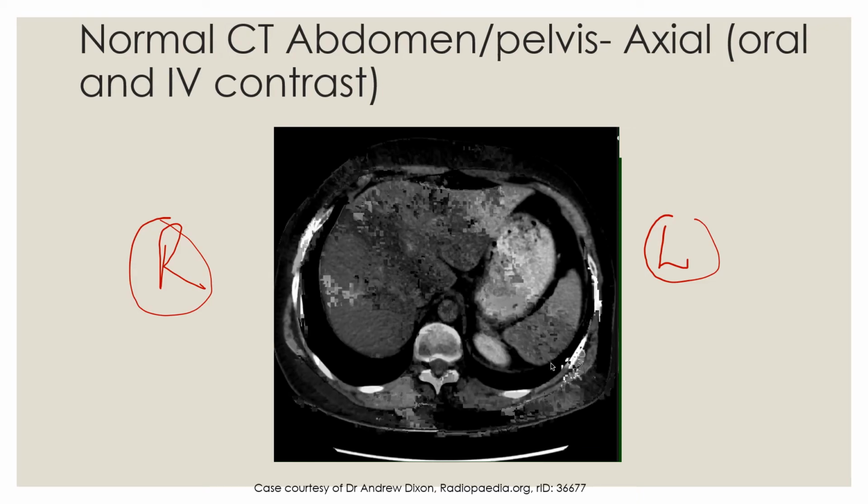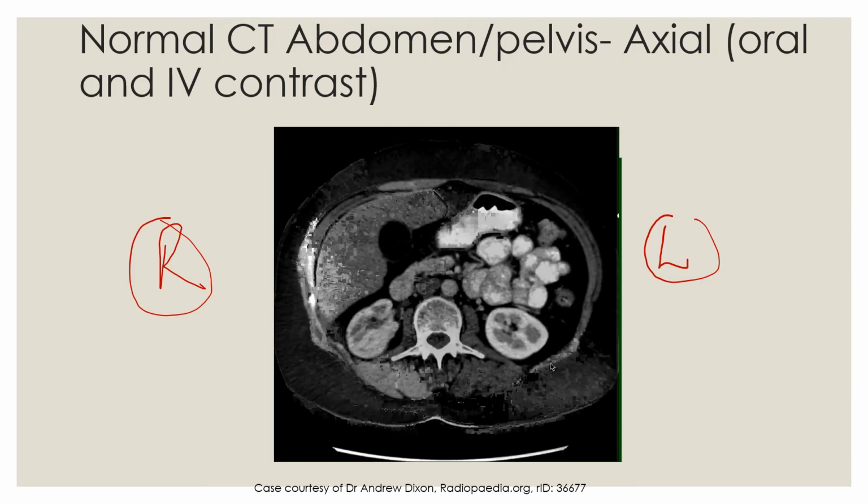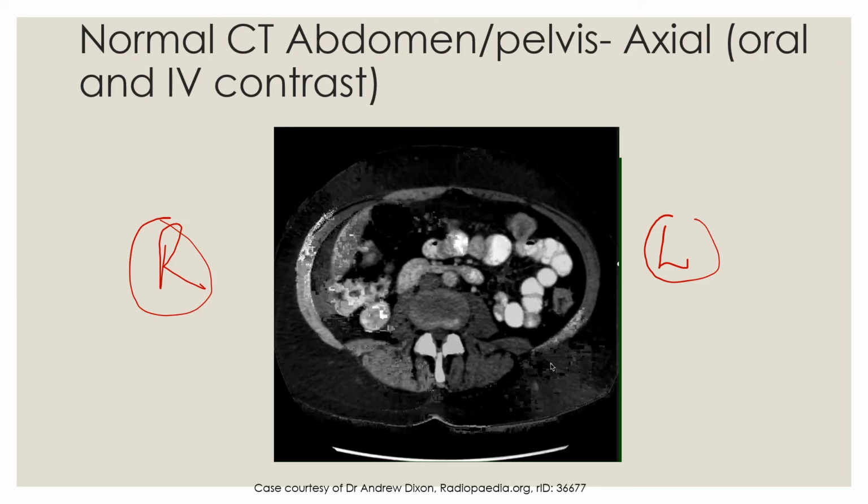Another thing I would like to show you is the spleen. As we saw in the previous imaging, here is our spleen. And so that's our HPB system. I would also want to show you the biliary system. When the biliary system is normal, we don't really see it. If the biliary system is abnormal and dilated, then we can assess it a bit better.